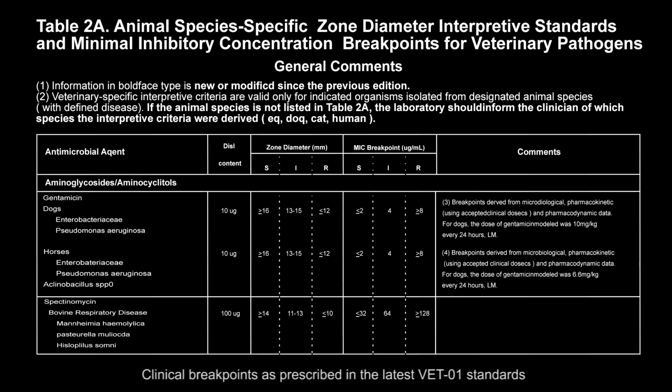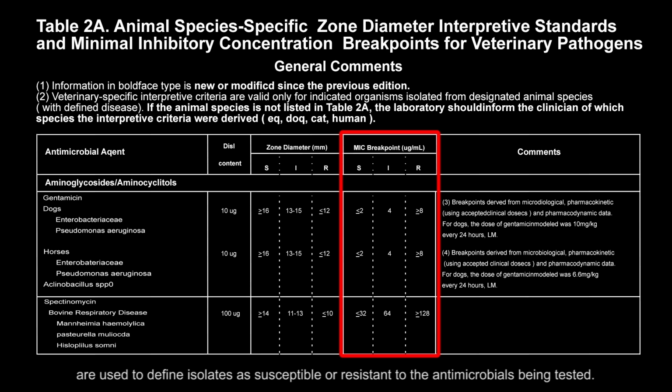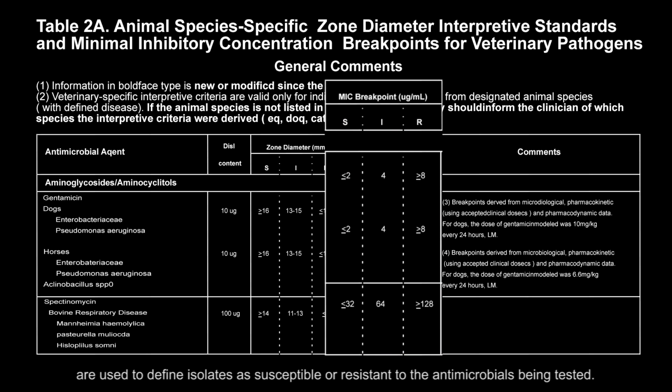Clinical breakpoints as prescribed in the latest VET01 standards are used to define isolates as susceptible or resistant to the antimicrobials being tested.